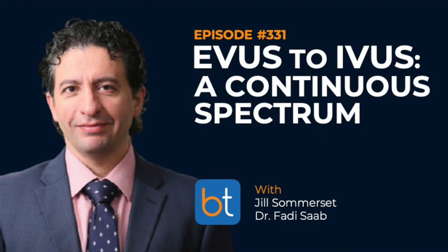Jill? Yeah, I mean, that case that you saw, Abby, it was a flush SFA occlusion and a nice concave cap from the foot, and it was lovely, and I think the success is higher. It's easier on the patient, and as you've said before, it's the safety. I mean, gosh, just like you, we use ultrasound for closure of the pedal access site. It's really, really lovely. I'm also curious, Dr. Saab, about when you cross, tell me about your algorithm of when you're introducing IVUS.